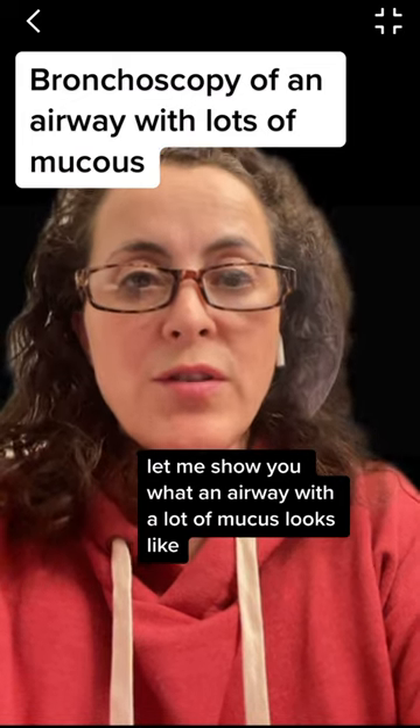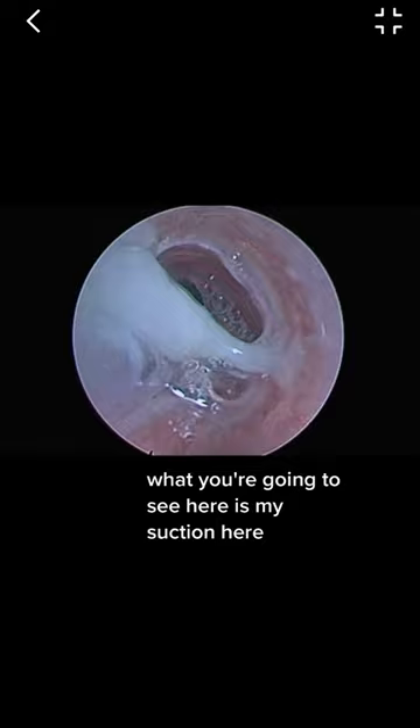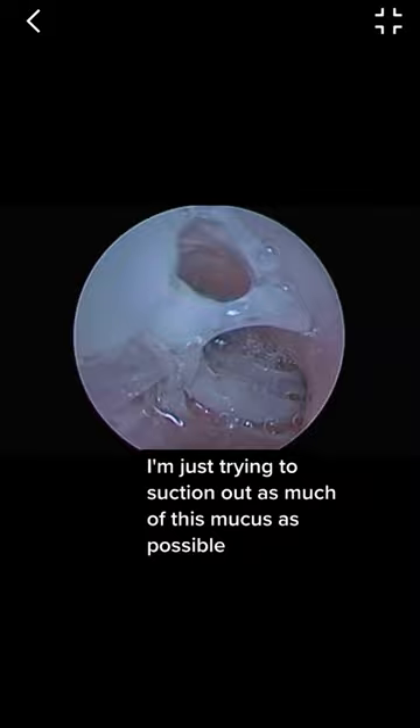This is what an airway with a lot of mucus looks like. In previous videos we saw this is the trachea, and here it has lots of mucus. Here we have the right main stem bronchi and the left main stem bronchi. What you're going to see here is my suction — that's the clear tubing on the left — and I'm just trying to suction out as much of this mucus as possible.